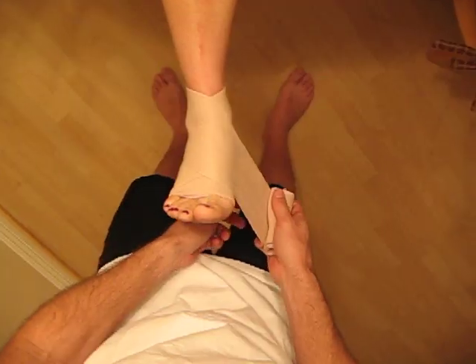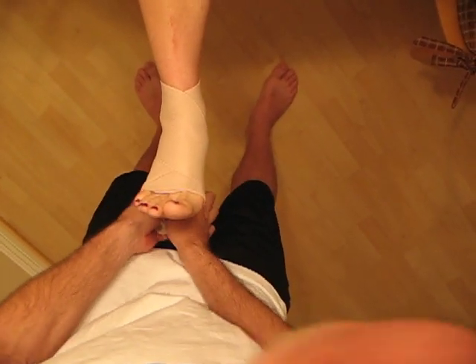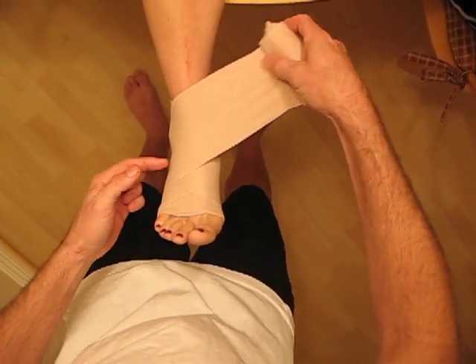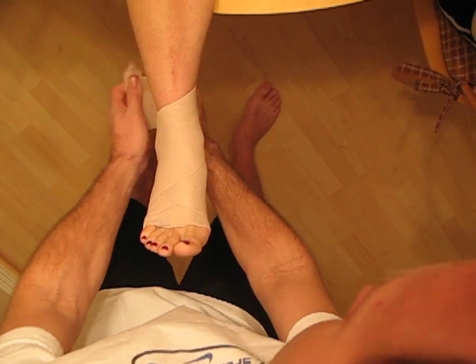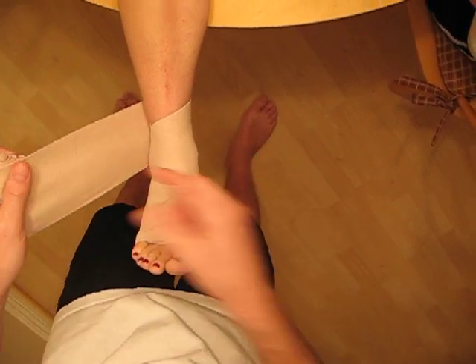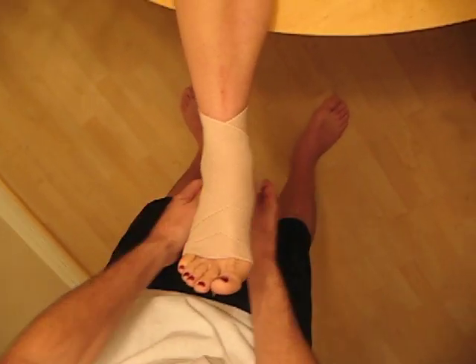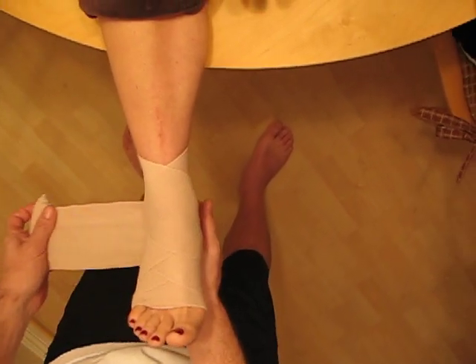And now I have the beginning of the spica pattern. Now I come back under the foot, and this one again overlapping, and slightly coming up a little higher — again, over the foot, straight across. I've got my tail here, and this time back down in this manner.